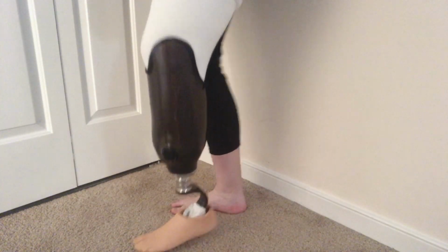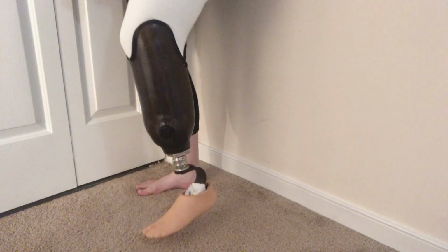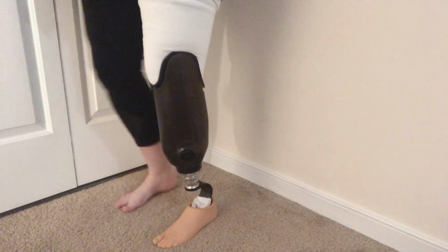My husband is blowing leaves outside, so you can't really hear it, but the 6 fits fairly well with the fatter ring, but it's making that sound. Listen. That means I don't have suction and I have to try something else.